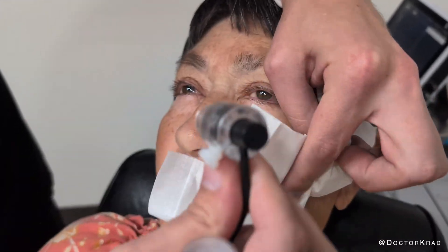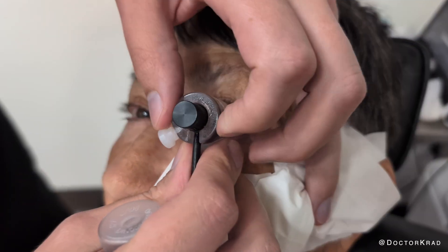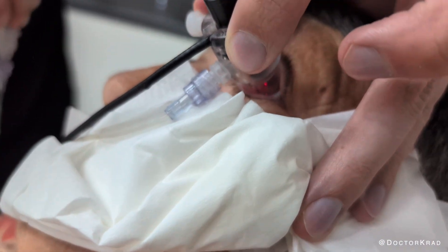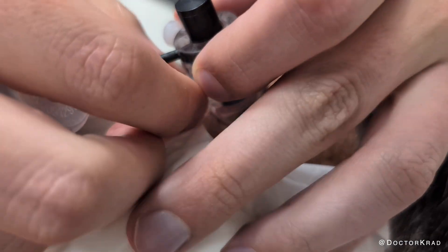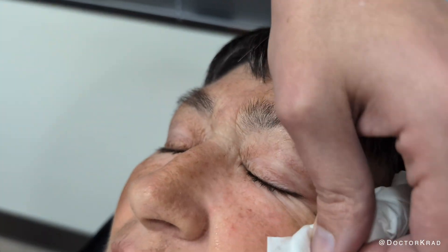We're going to start. So, can you look at the light here? Look at the light — it's important. Look at the light, okay? It's done. Very good. Close the eye. Perfect. Very, very good.